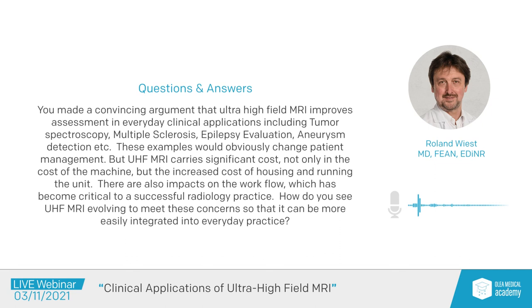I think something that is really important is to convince, and that's the stage where we are currently in. We want to provide evidence that having the ultra high field early in the diagnostic workup can help to avoid additional and non-confirmatory 3 Tesla examinations.